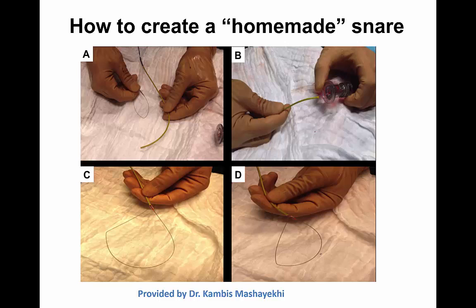However, when such a snare is not available, there are ways to make a homemade snare with adjustable width. To make this, what is needed is a guide catheter extension, a regular monorail balloon, and a 0.014 guide wire.